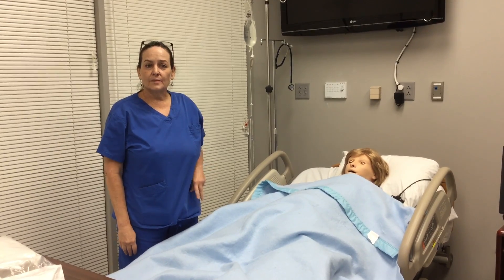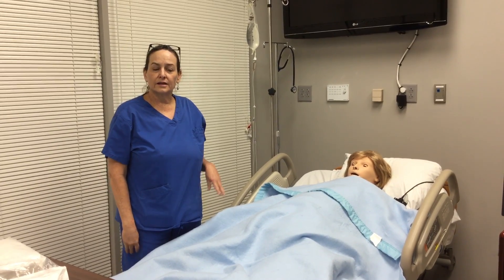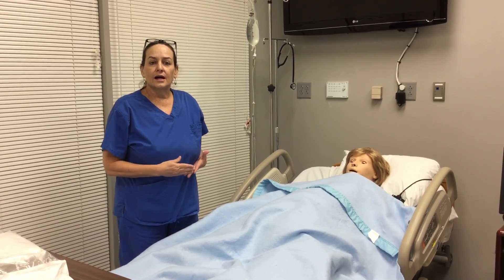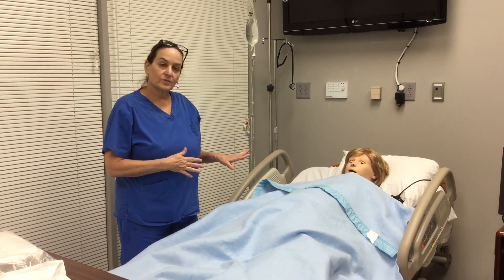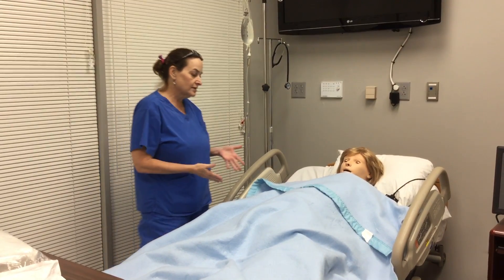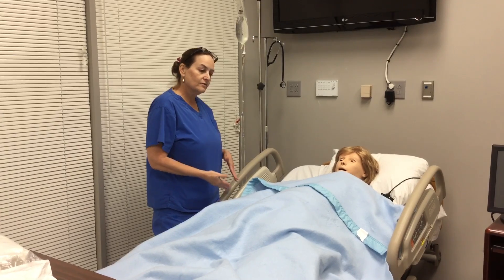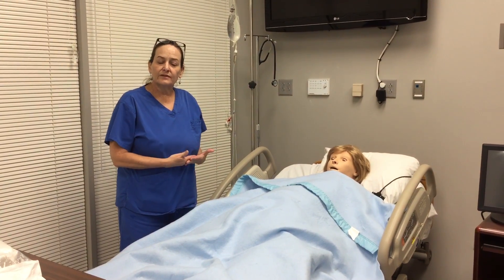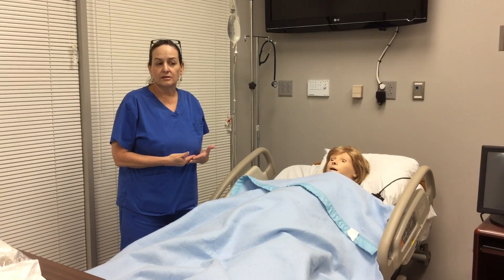Today we're going to talk about putting a Foley catheter in a woman who is in labor and has an epidural. I'm going to walk through the procedure from beginning to end. You're going to walk in and explain to your patient why you're doing the Foley catheter. In most pregnant women in labor who have an epidural, they're going to need a Foley catheter.